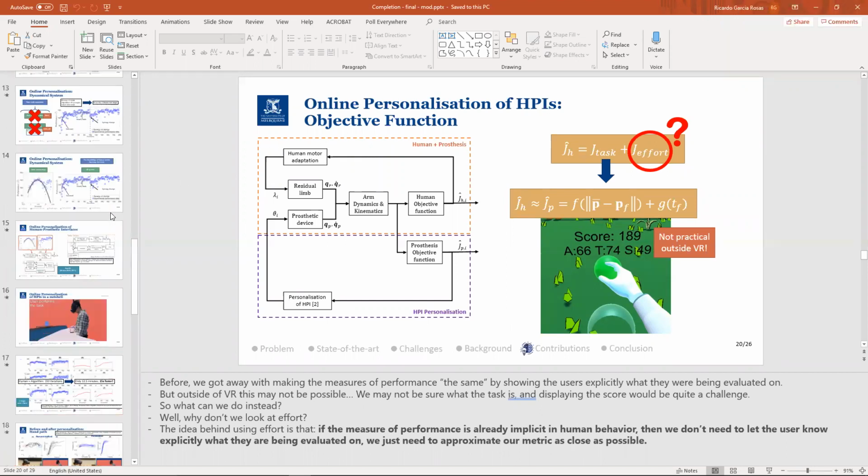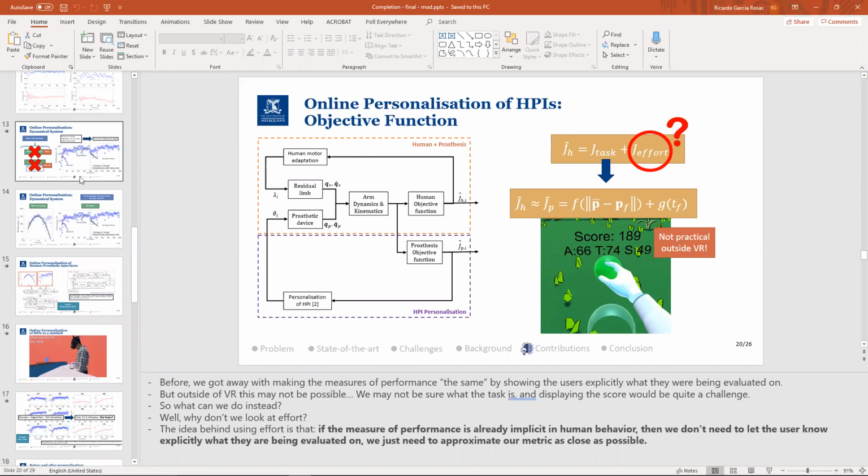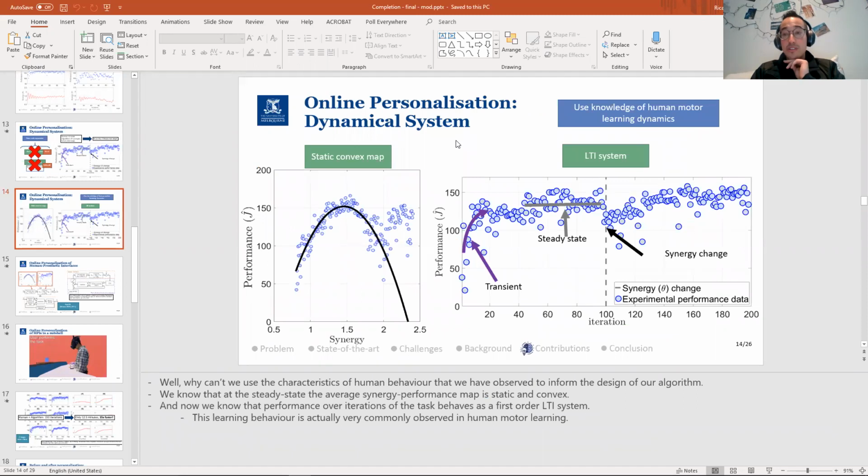But does learning reach a steady state? Do you learn a new steady state just by repeating the action once? I guess, no. Sorry, do you mean from the human perspective? When you're repeating the task, does the extremum seeking loop at the bottom update the parameter for every repetition of the task? Yes. And so the assumption would be that after each repetition, the human has already learned how to move with the new parameter in one iteration.